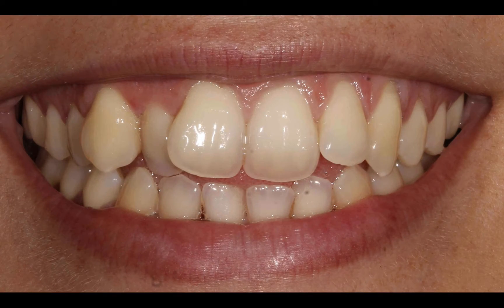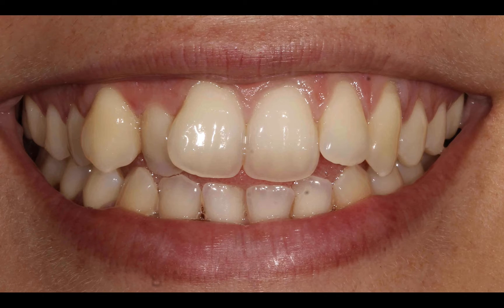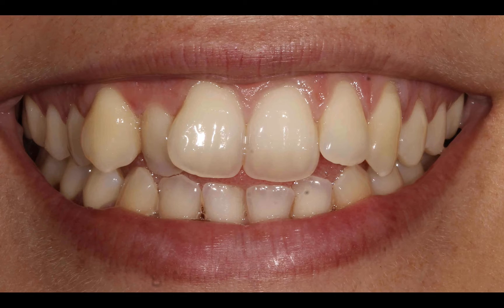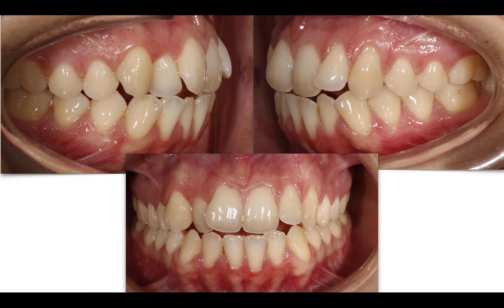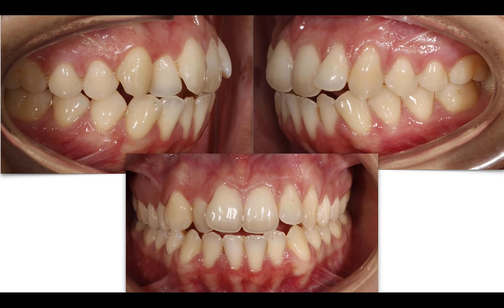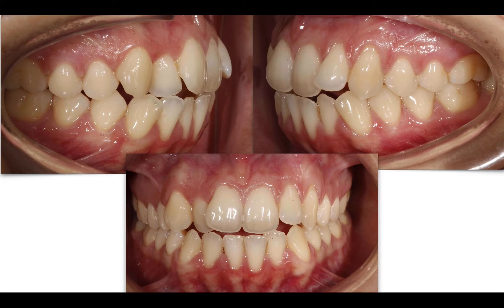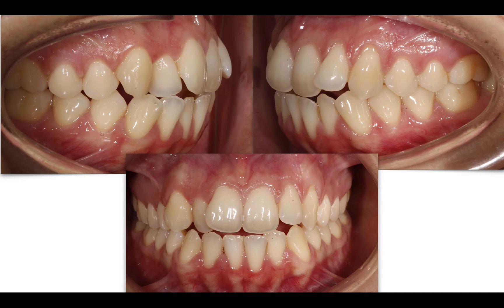The situation she presented at the beginning was: super crowding, open bite, anterior crossbite with the lateral inside, narrow arch, and she was also developing some periodontal recessions. You can see the severe open bite she was developing, as well as the canting of the midlines.